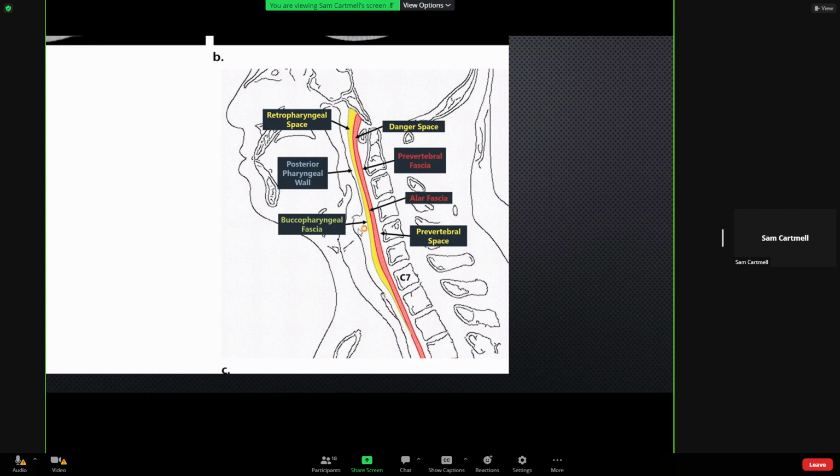which is a really important thing to be aware of, so that if you're reading a CT neck, say, you scrutinize the mediastinum to make sure that there's no spread, because that can be hard to identify because the symptoms are sort of nonspecific sometimes, and it's also a devastating complication. So very important to scrutinize.